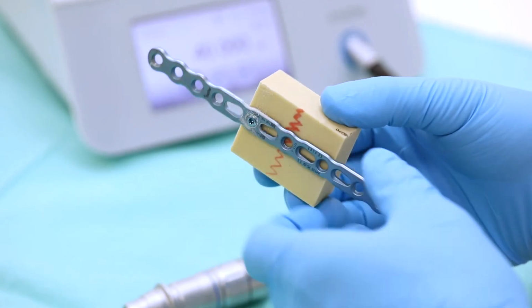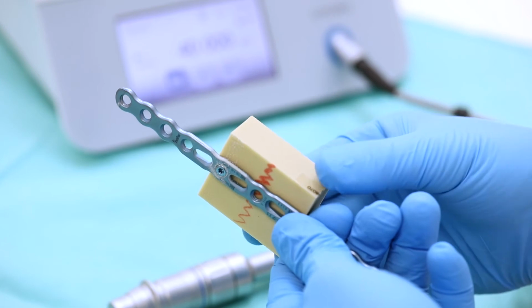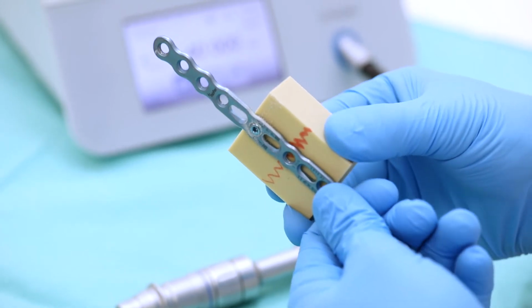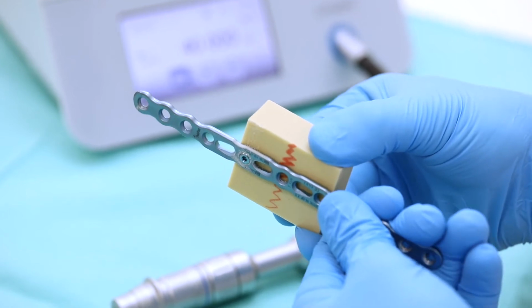If we have a good bone, this screw will hold the plate in place. In very osteoporotic patients, this screw could loosen after a while.